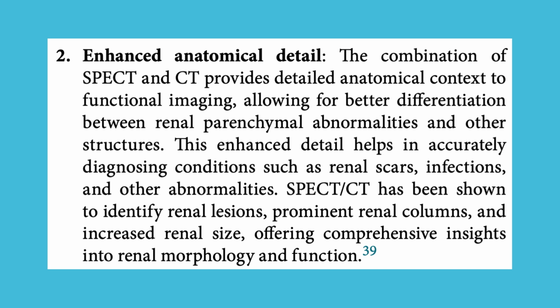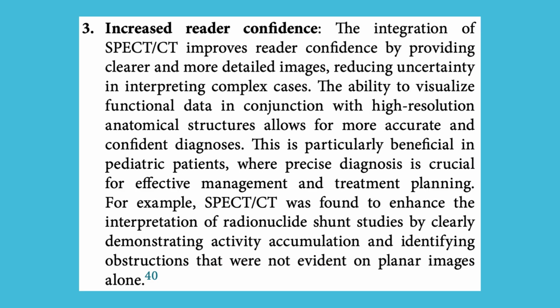2. Enhanced anatomical detail. The combination of SPECT and CT provides detailed anatomical context to functional imaging, allowing for better differentiation between renal parenchymal abnormalities and other structures. This enhanced detail helps in accurately diagnosing conditions such as renal scars, infections, and other abnormalities. SPECT/CT has been shown to identify renal lesions, prominent renal columns, and increased renal size, offering comprehensive insights into renal morphology and function.